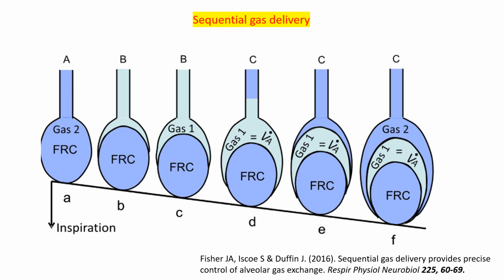This picture summarizes what has happened during the inspiration, starting at the end of expiration on the left and showing how gas 1 enters the functional residual capacity and the alveolar space where gas exchange with pulmonary blood occurs. And at the start, A, the FRC and airways are filled with expired gas. During phase B, gas 1 is inspired, eventually collapsing the gas 1 reservoir, so that during phase C, expired gas 2 is sequentially administered via the crossover valve.